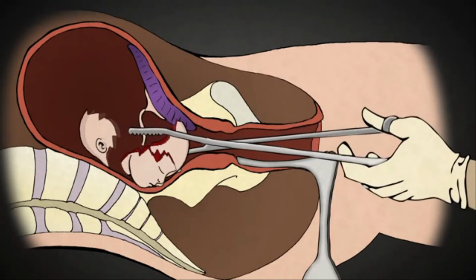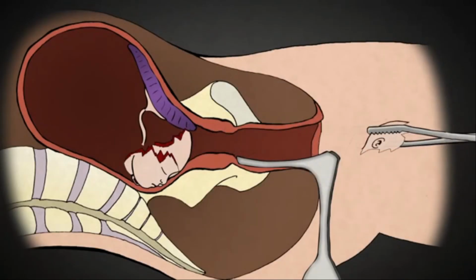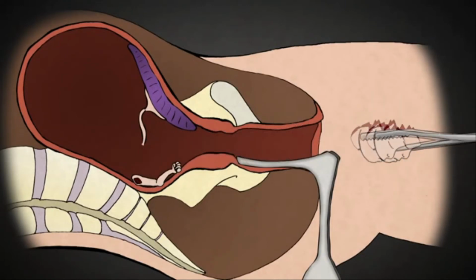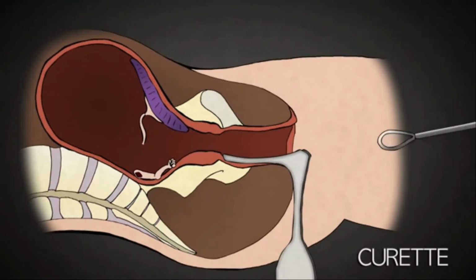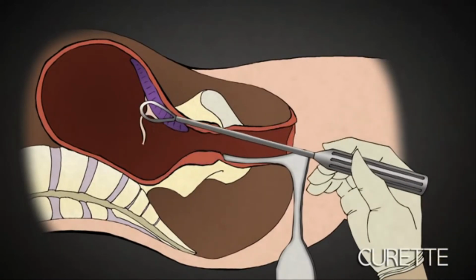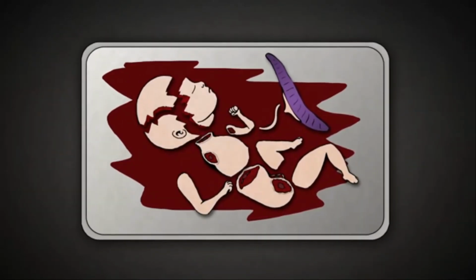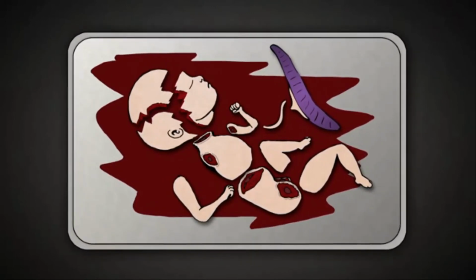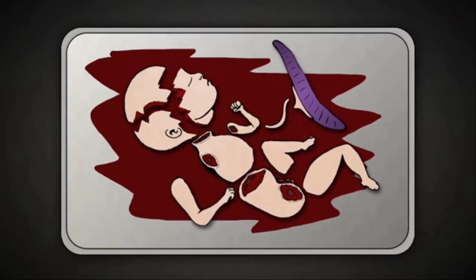The head is grasped and crushed. The abortionist knows he has crushed the skull when a white substance comes out of the cervix. This was the baby's brains. The abortionist then removes skull pieces. He removes the placenta and any leftover parts of the baby with a curette, scraping the lining of the uterus for any remaining tissue. The abortionist then collects the baby parts and reassembles them to make sure that there are 2 arms, 2 legs, and all the pieces. Once all the parts have been accounted for, the abortion is complete.